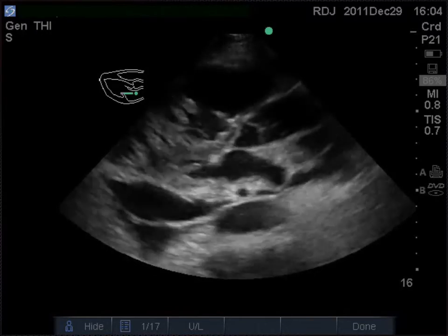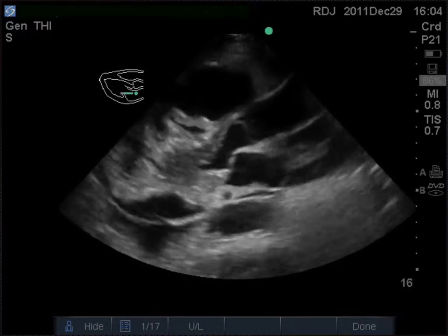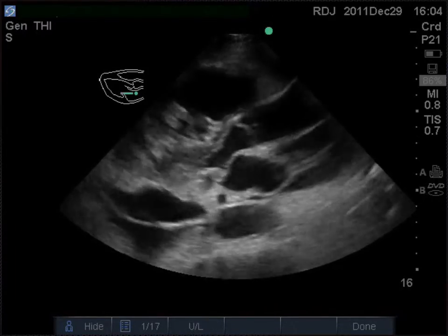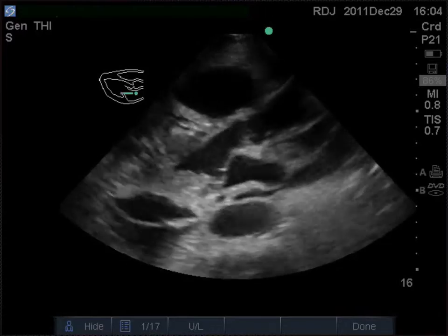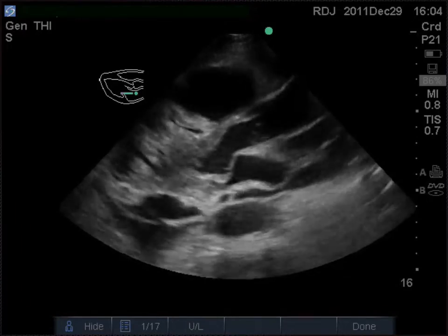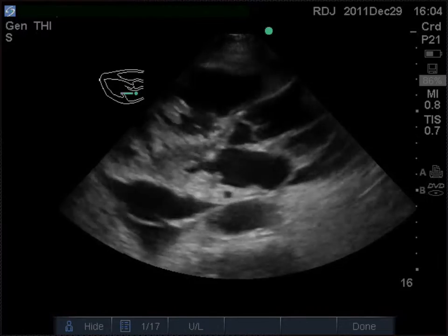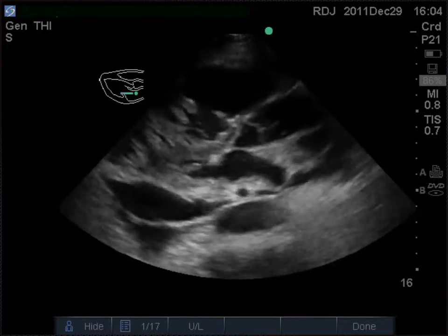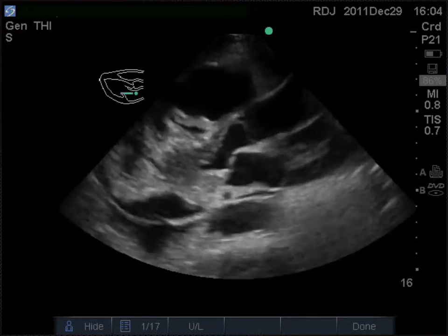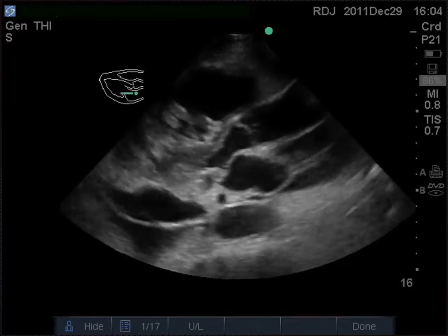So the other thing to note is the descending thoracic aorta. Now, if you look at the descending thoracic aorta here, above and to the left is fluid. So there is pericardial fluid around the posterior wall, and also underneath the left atrium. Now you can see also there's a little black spot below the left atrium of the heart, attached to the posterior wall of the left atrium, and that's actually the coronary sinus. So you don't often see that, but it's the coronary sinus of the heart.